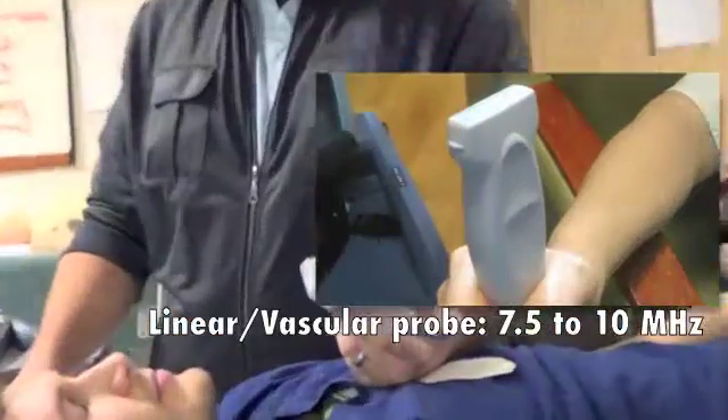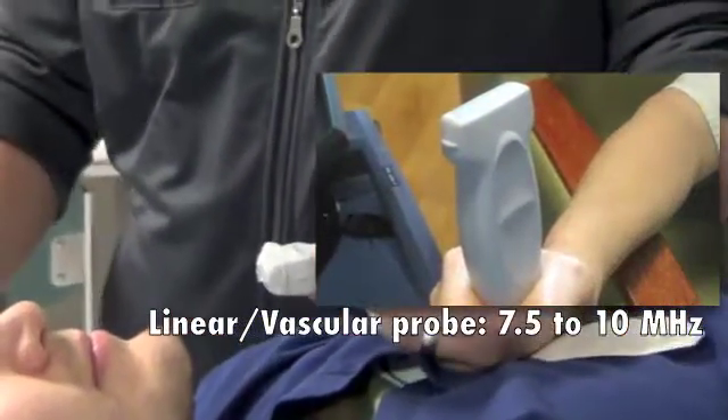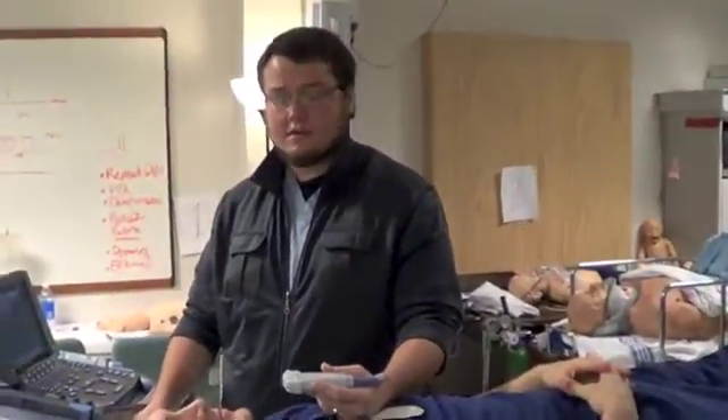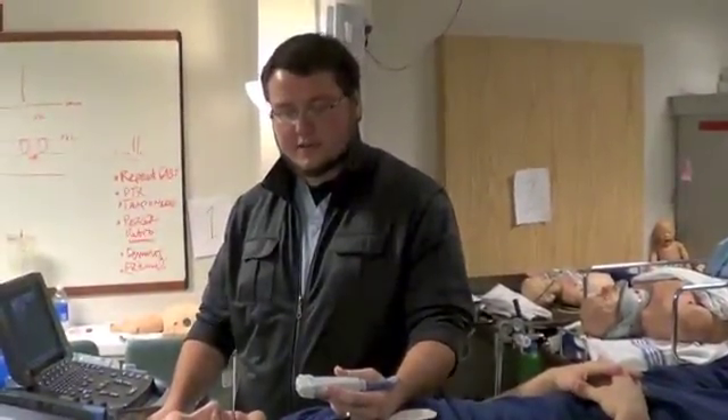The probe you're going to use is the linear probe. There are other probes specialized for the optic nerve, but in most ERs and critical care settings you're going to be using the linear probe.